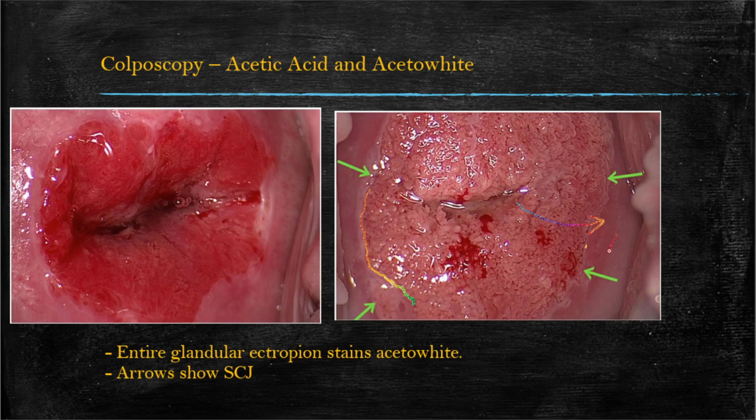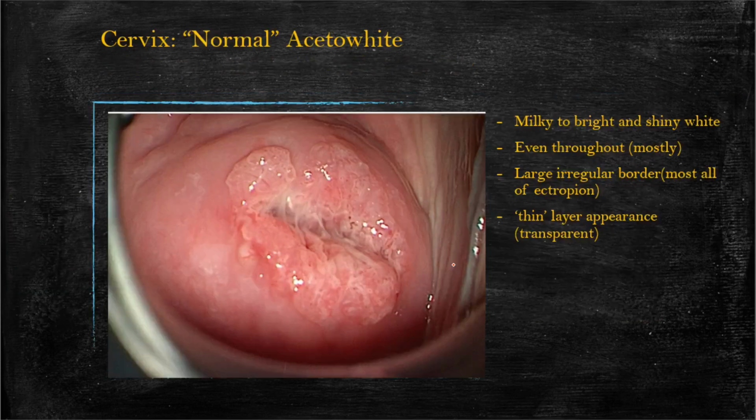I could be maybe convinced that this is our original squamocolumnar junction here, and the new one here, with this being our transformation zone in the middle. You can kind of see that down here as well with this new area, and look, there's a little crypt right there that's probably going to get covered over, possibly be a Nabothian.